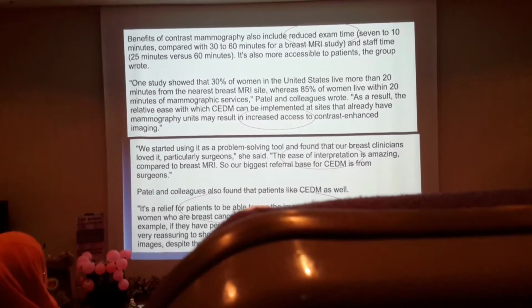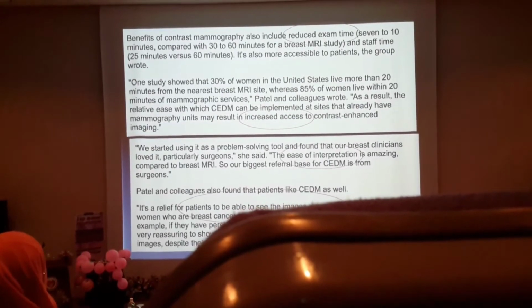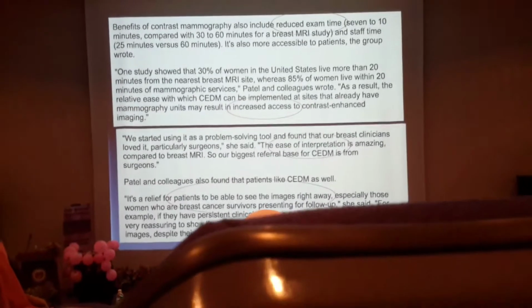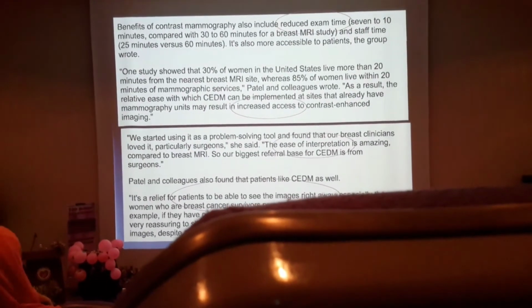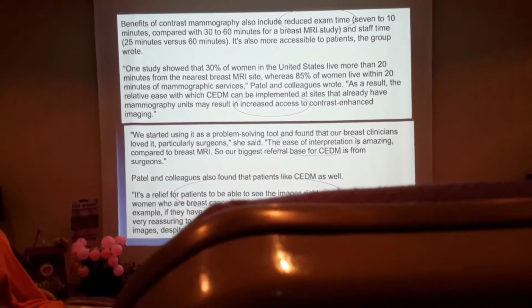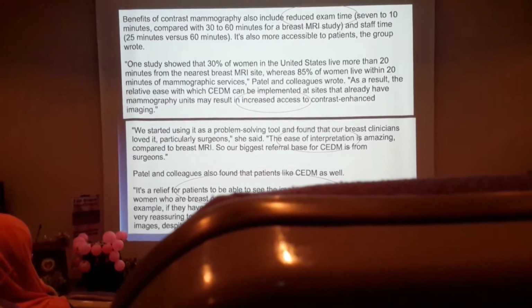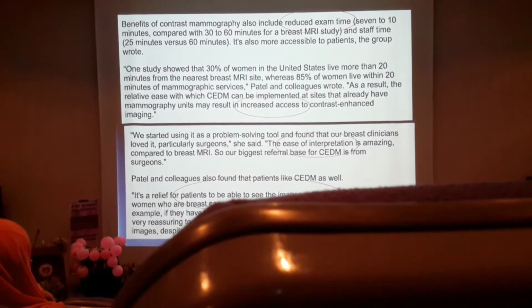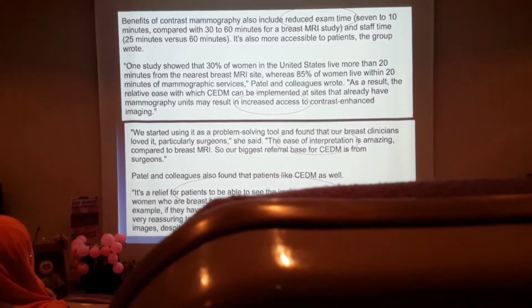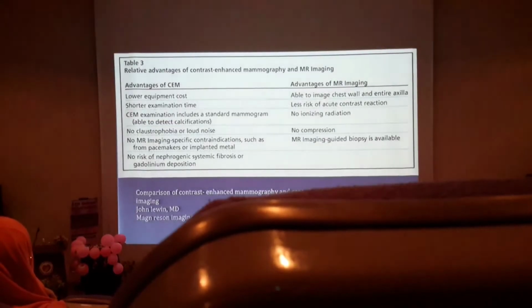All right, and the patients are able to see their results the same day. So what we do is, in the unit, we have an ultrasound machine in the next room. If we find anything enhancing, the patient is immediately called in. We do a second look ultrasound immediately, not like an MRI where we have to call the patient back after 2 weeks. And we biopsy the new lesion that's enhancing immediately. So within 2 days, the patient's got the biopsy result of any other multifocal lesion that's detected on the mammogram.